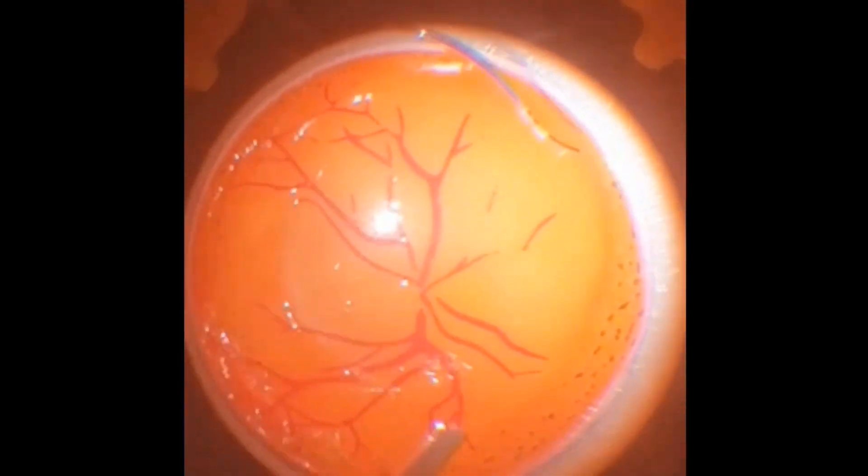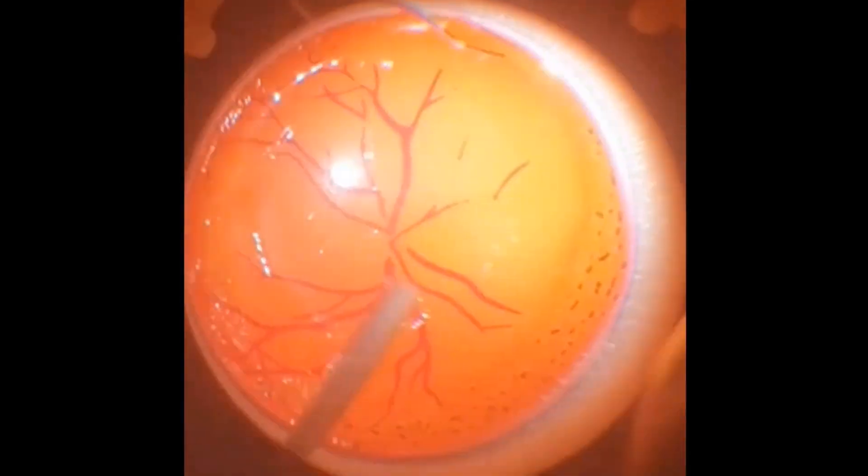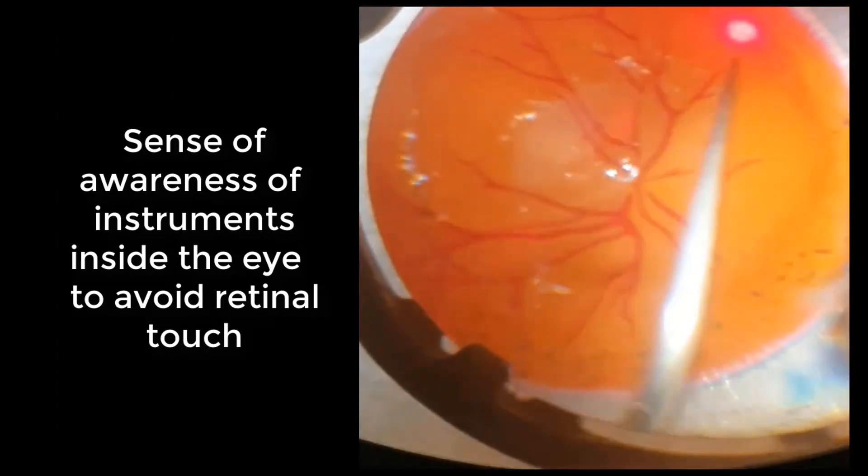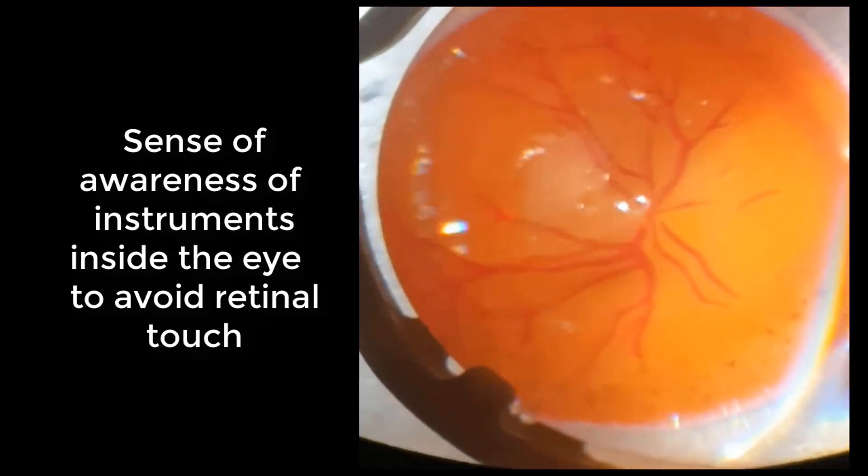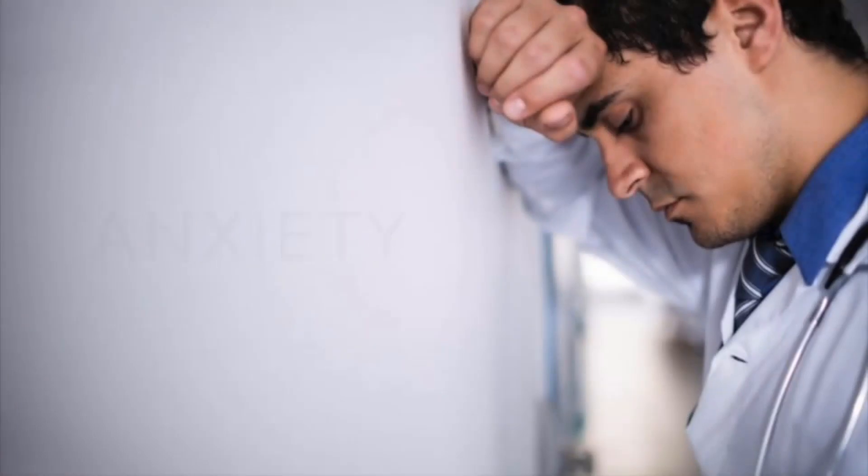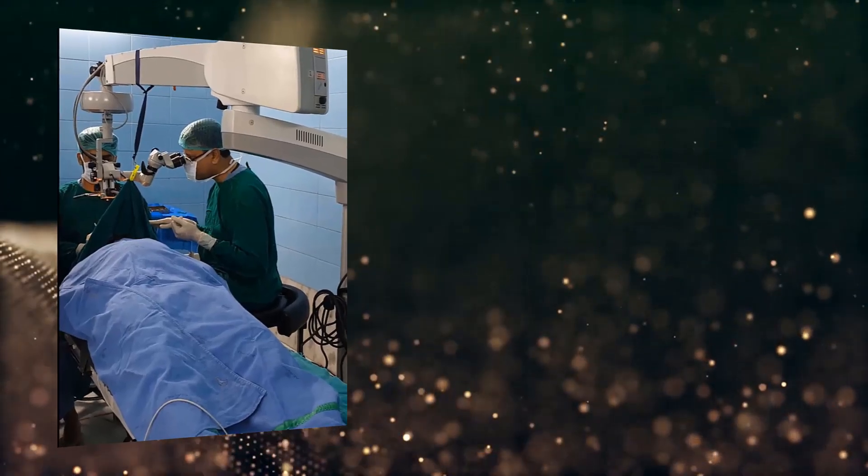Endo laser can be practiced on the PETG film which produces burns comparable to human retina. It also creates a sense of awareness of instruments inside the eye to avoid touch. It also decreases anxiety and complications and improves performance.